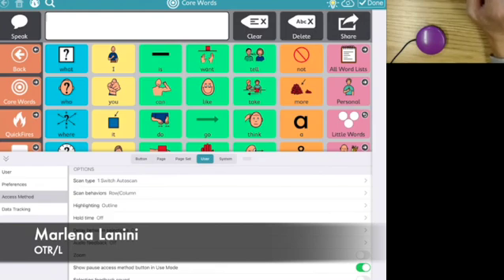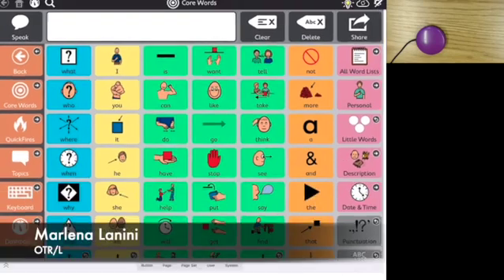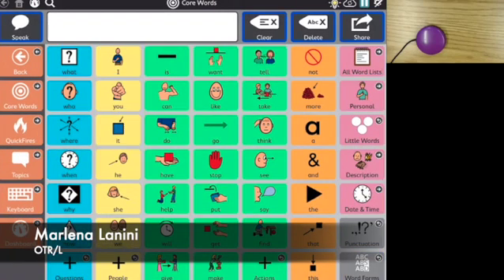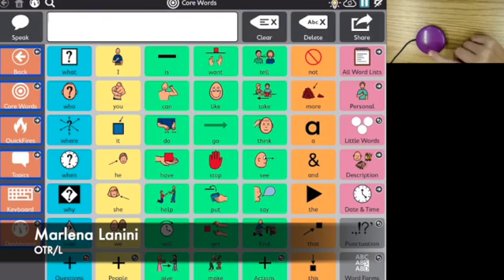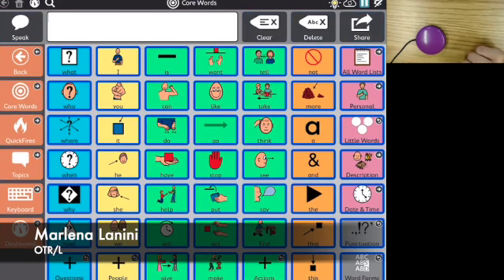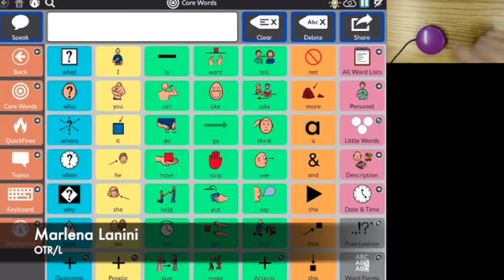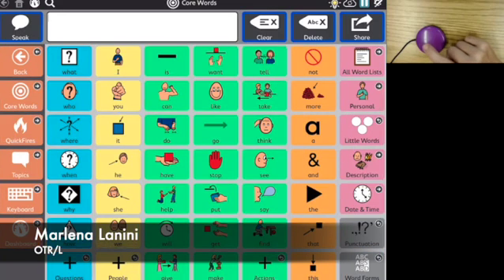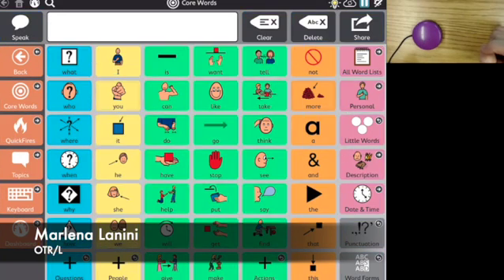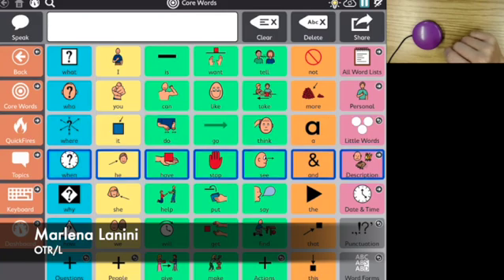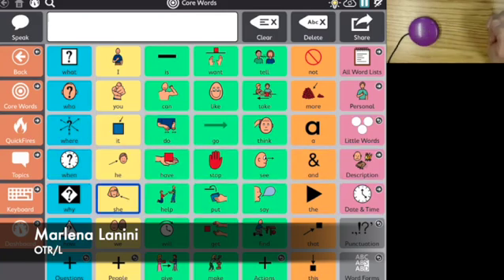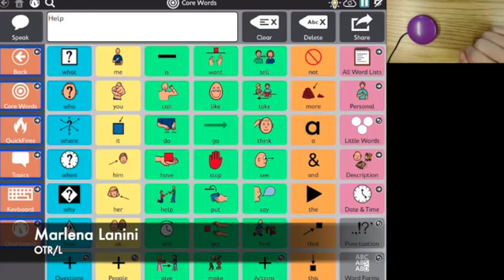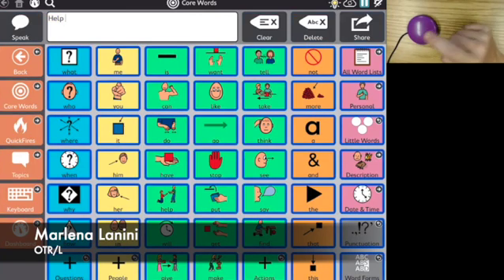I'm going to start with one switch auto scan so you can see what that looks like. Once I've turned that on, my communication app automatically starts scanning through the choices. I haven't had to touch this switch at all yet. In order for me to speak the word that I want, I need to wait until it gets to the item I want and then hit my switch. Wait for it to get to the word I want, and then it's going to say my word out loud.